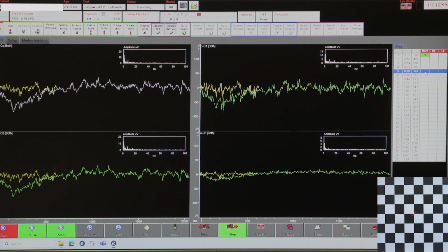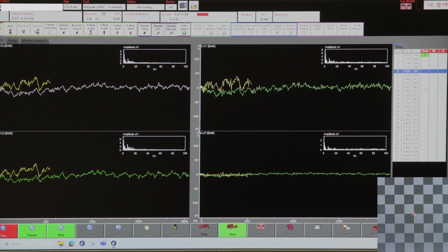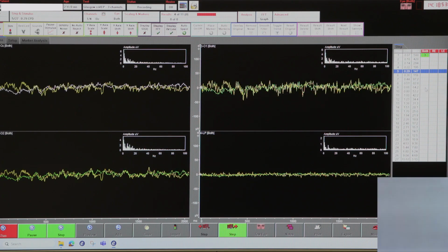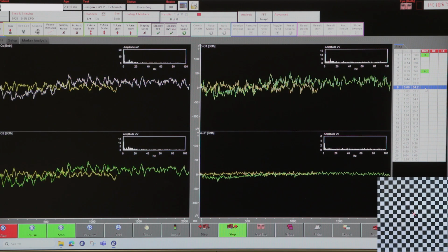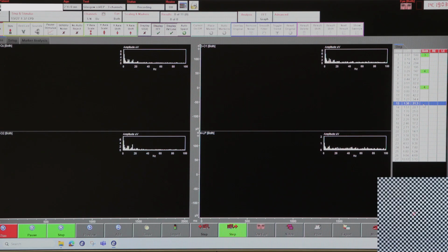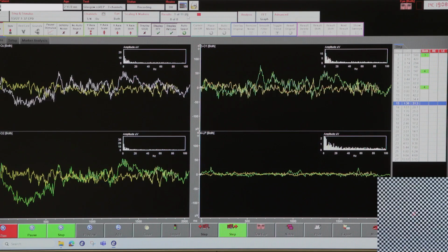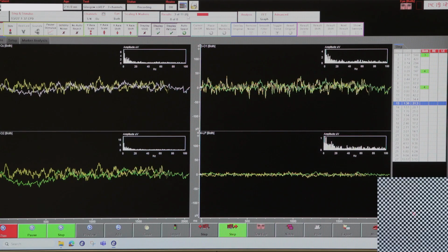Let's watch another example. A few things to notice here. The process always begins with large checks because we designed the system to maximise the amount of time a child was looking at a stimulus which they could see. Notice also the low noise level on the Laplacian channel. Those close reference electrodes are very effective at cancelling noise but preserve a lot of the signal. So often the Laplacian has better signal to noise ratio than the real channels.